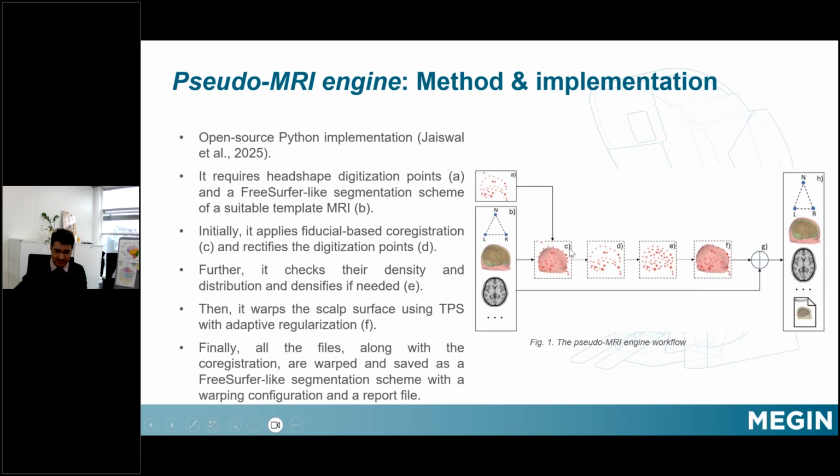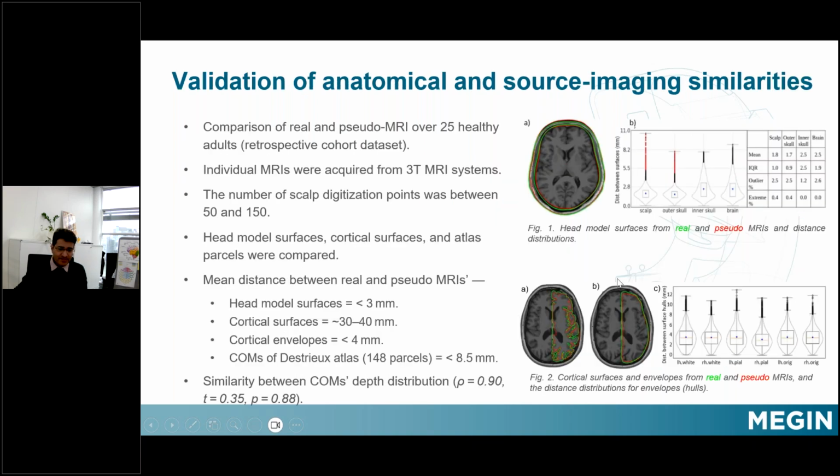co-registration, because if you remember at stage C, we co-registered first. So the warp transformation file is stored. So you don't require any more MEG or EEG to MRI co-registration. That is also done in this pipeline. And then in the end, you get an HTML report, so you can cross-check your result and see how well it has gone.